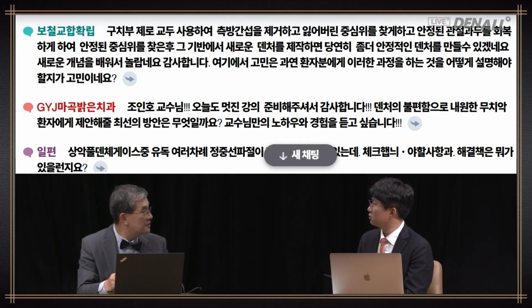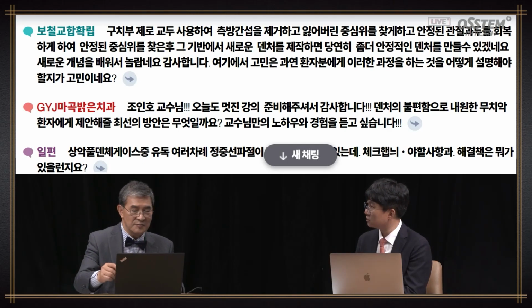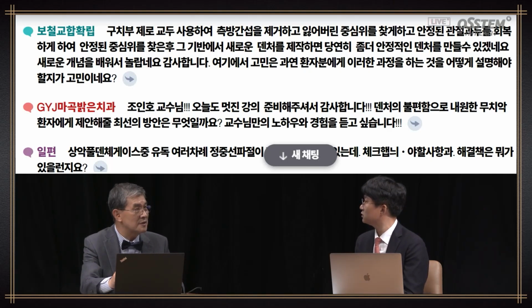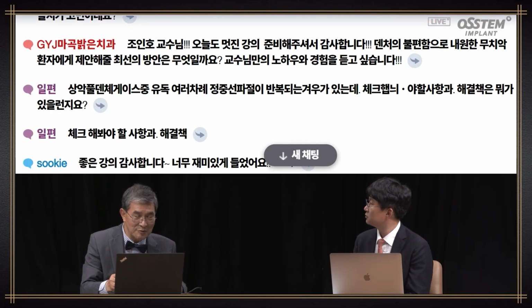The concept of the flat table that I explained is a little bit different from the 0-degree cusp teeth. The concept was to make only the upper palatal cusps be in contact with the flat table. We are talking about patients with unstable TMJ, so we need to go through trial and error. With aging, the joint is weakened and the disc is changed, so we need to go through some adaptation, which I explain to patients.